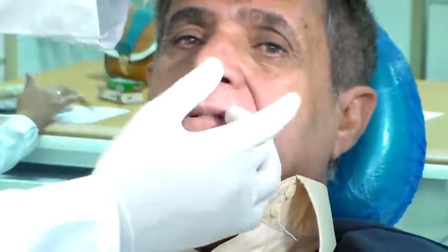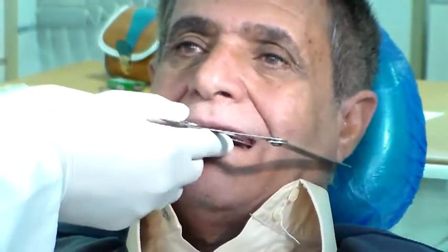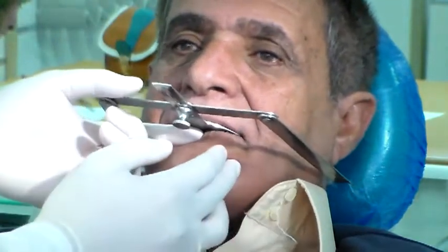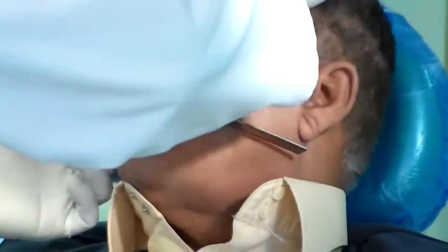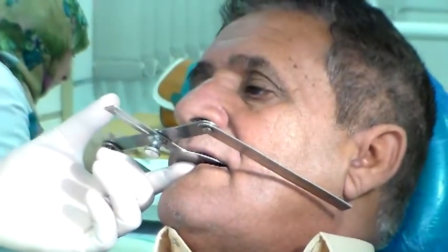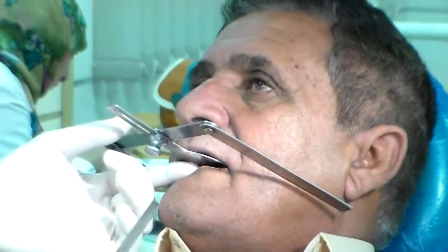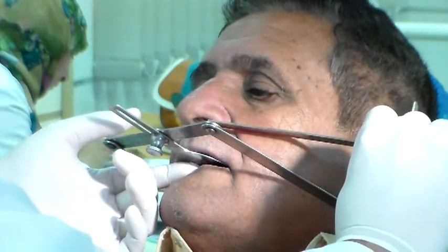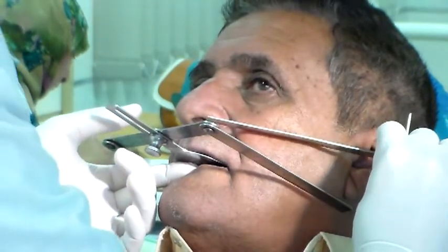The anterior has been corrected and we are just a little over. I want to correct the posterior part of my plane as well. So let me use my fox plane and turn the patient's face so I can see my posterior arm of the fox plane. And I want to place my ruler from the bottom of the ala to the middle of the tragus.